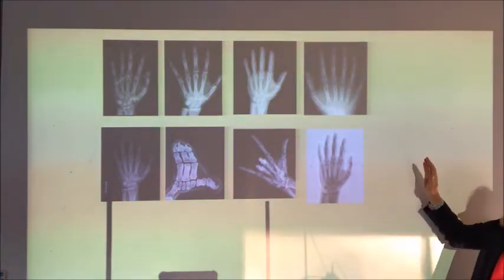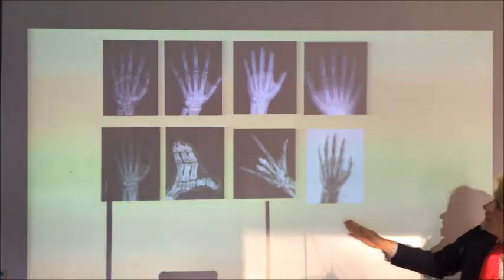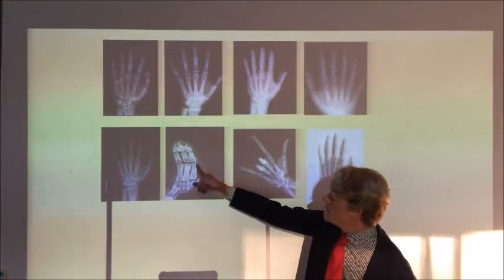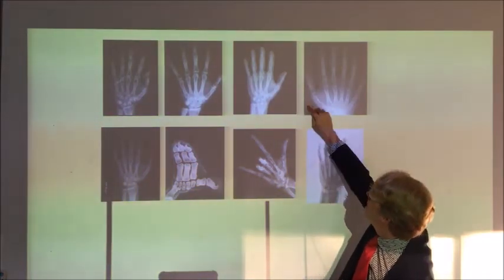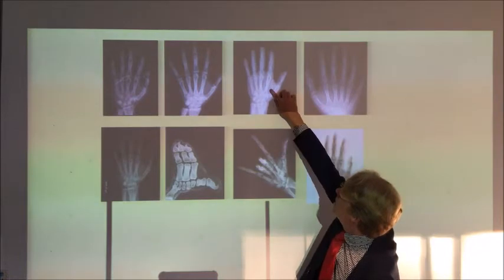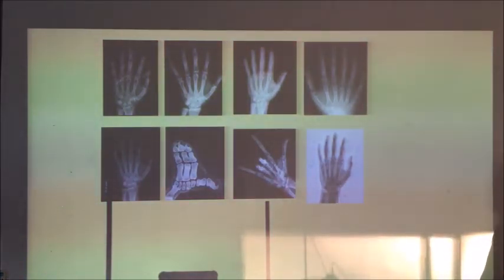So contrast, very clear black and white. Sharpness is very, very straight, or very, very stiff in edges. They're not soft at all. Over on these bones here, they're slightly softer. Maybe that is probably because the contrast is not as high as it could be. So that's describing the images.